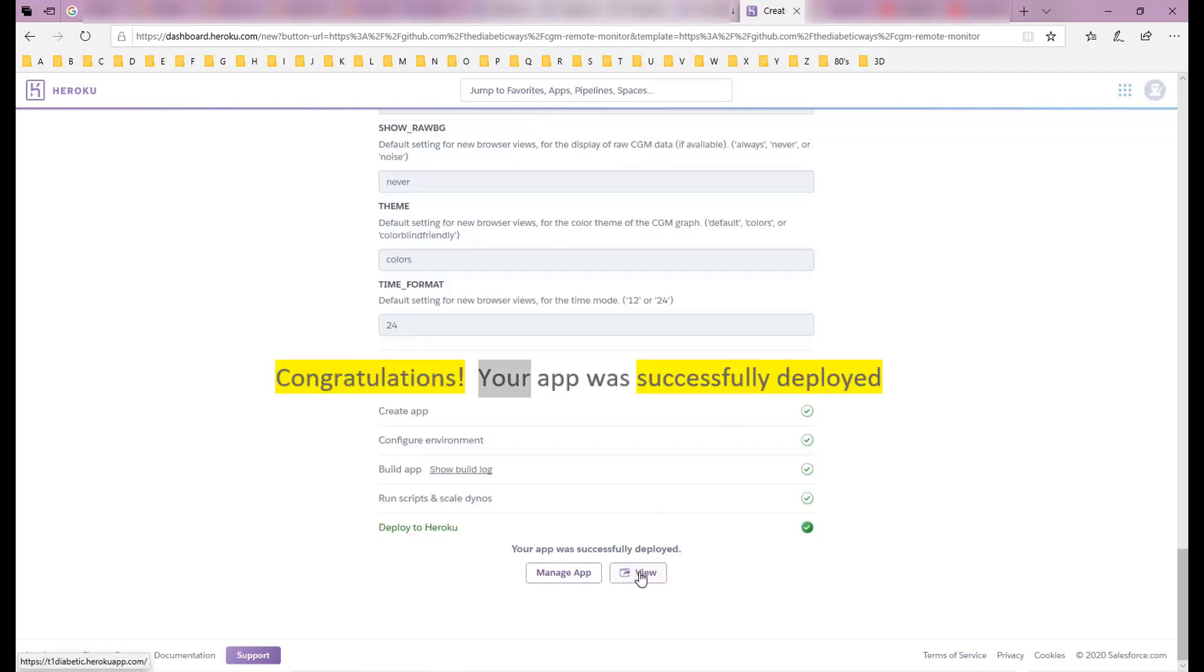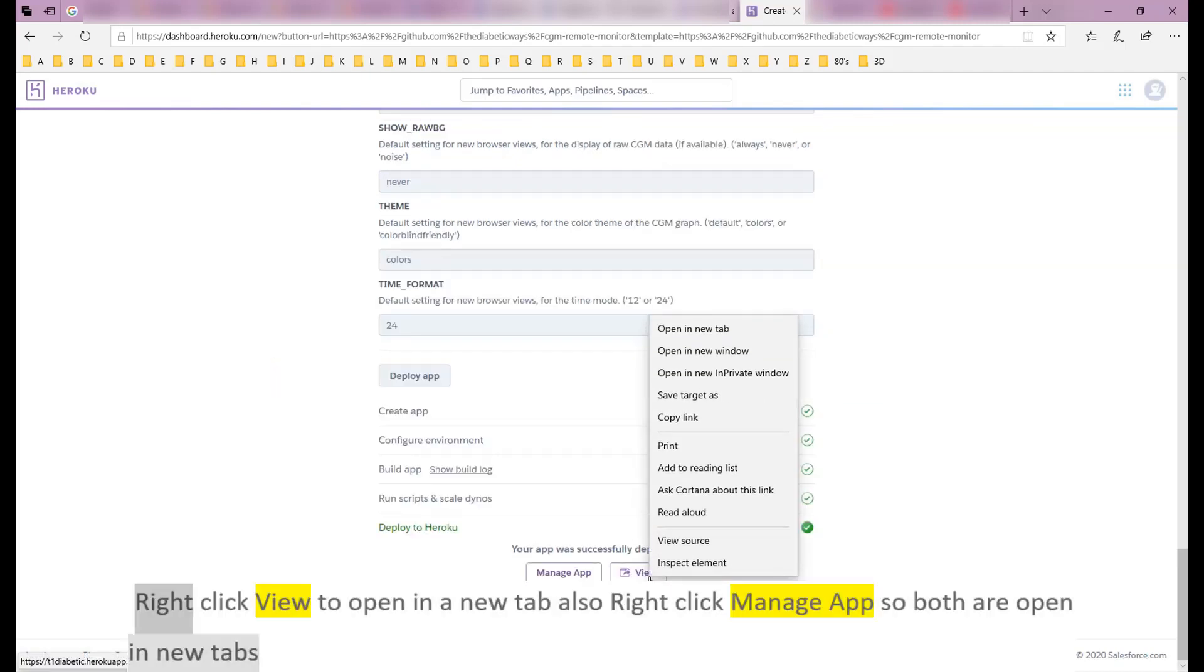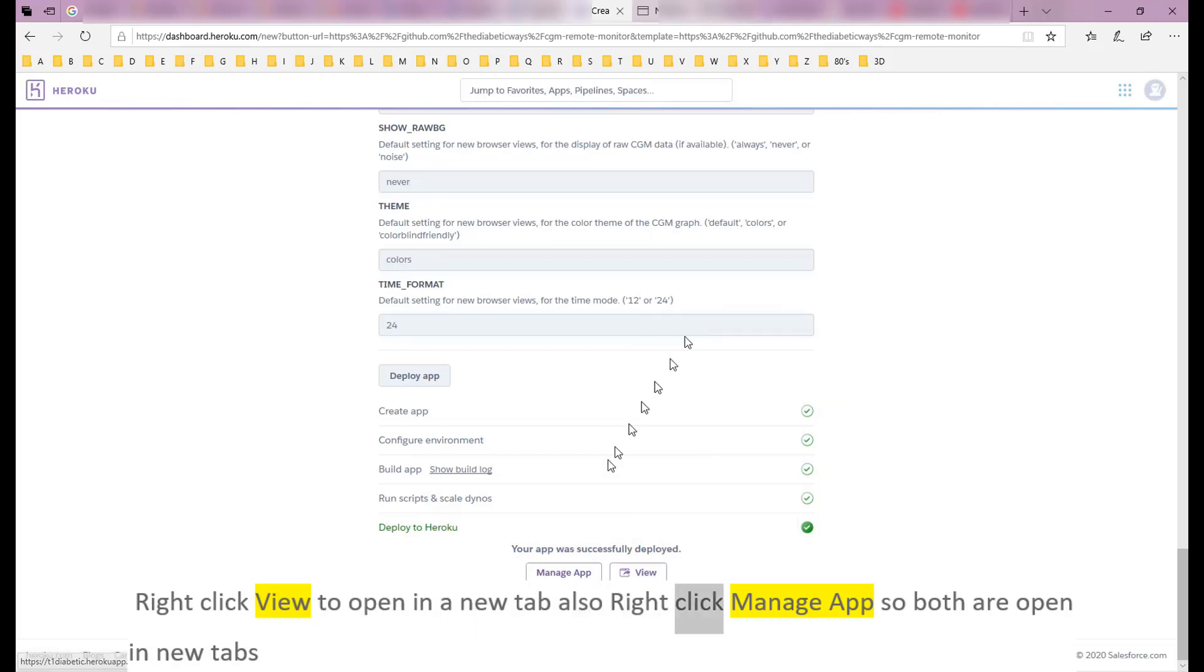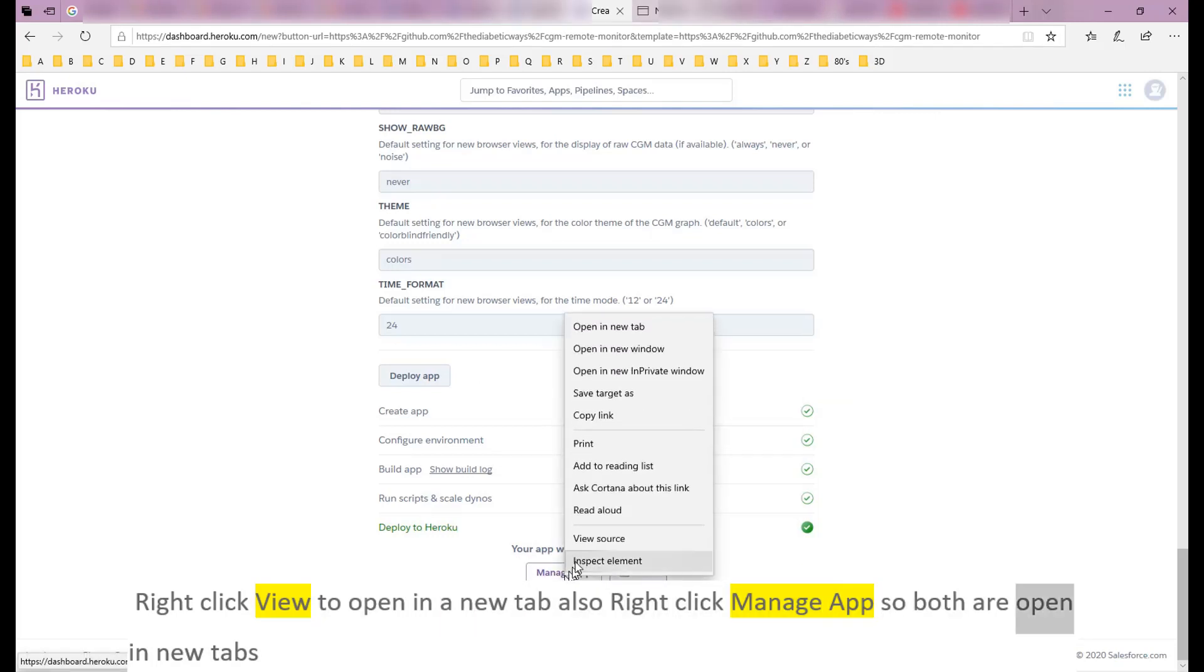Congratulations, your app was successfully deployed. Right-click View to open in a new tab. Right-click Manage App so both are open in new tabs.